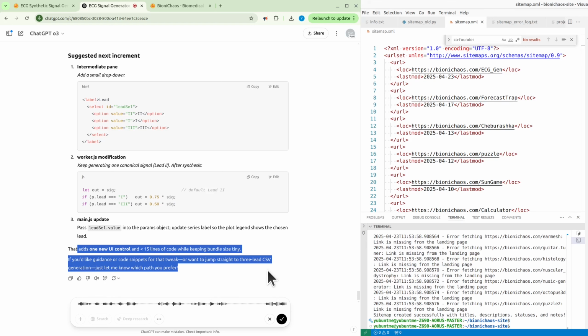But then in the settings, have an option to generate all the way up to 12 leads, so from 1 to 12. Obviously we need to consider whether that's just an option for the download, or whether it is what we are displaying on the screen as well, on the web application front page. How heavy is it? Is it too much to ask to display all 12 leads on the front panel?